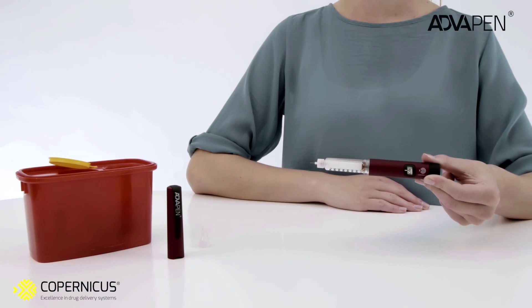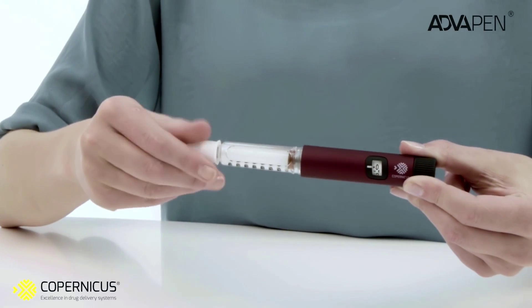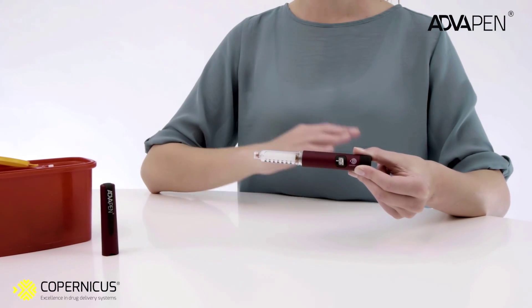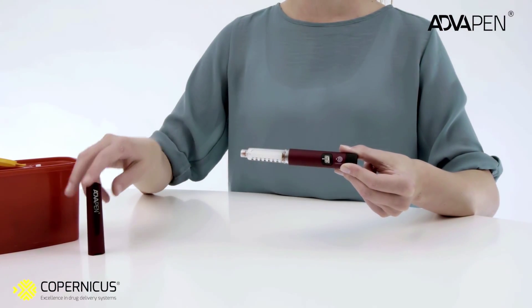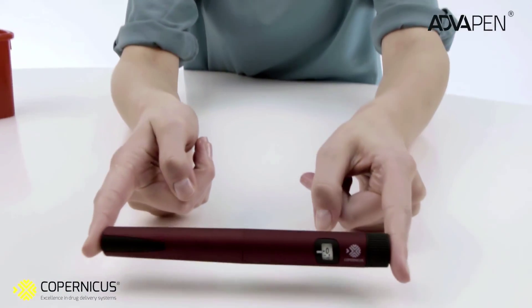After the injection is complete, put the outer needle shield back on the needle and rotate the outer needle shield counterclockwise to remove the used needle. Put your pen cap back on. You have completed your insulin injection.